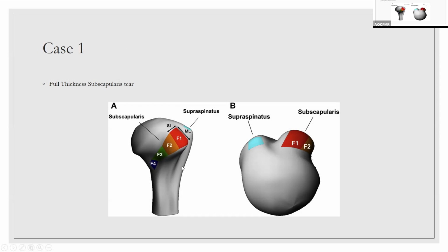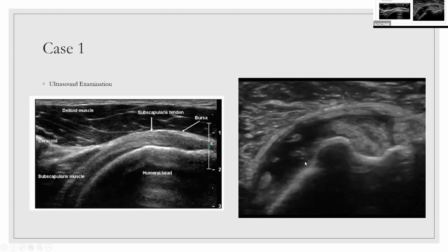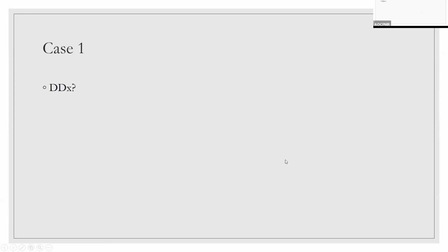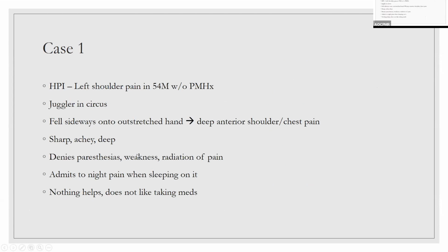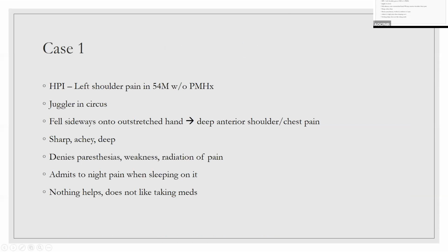So with this guy, we drained a lot of this hemorrhage, though we couldn't drain all of it. This is actually with half of it drained. He had a lot, so we ended up leaving some of it in there. We called it free PRP, and he actually did really well. He had some instability of the long head of the biceps tendon after that, which subluxing out of the intertubercular groove gave him more pain than the subscap, but he could still juggle. He still had plenty of collateral tendon remaining. So I thought that was a very interesting case.